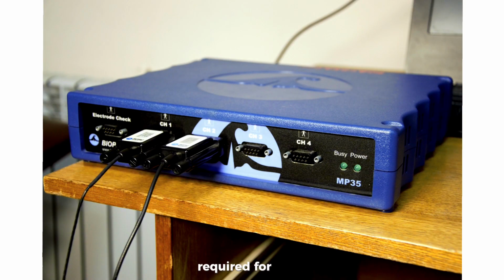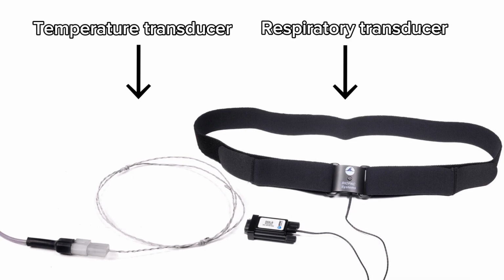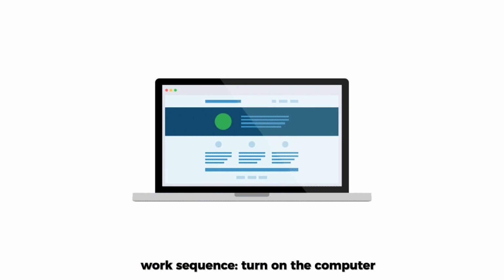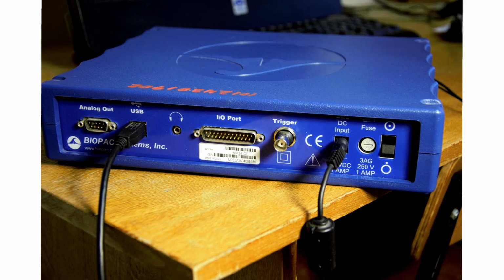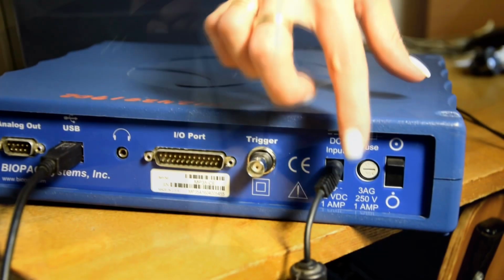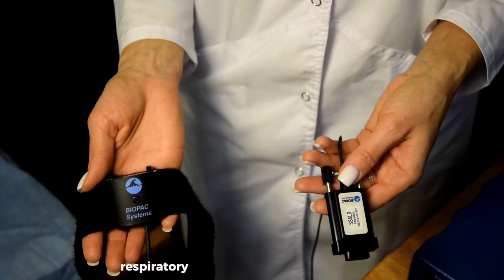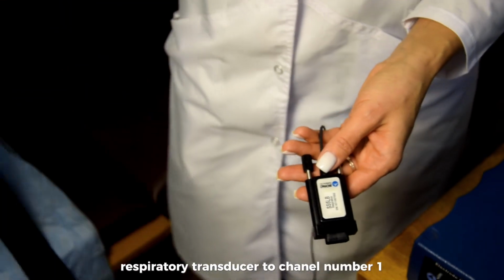Required for work: pneumograph which has respiratory and temperature transducers. Work sequence. Turn on the computer. Turn on the equipment. Connect the respiratory transducer to channel number 1.